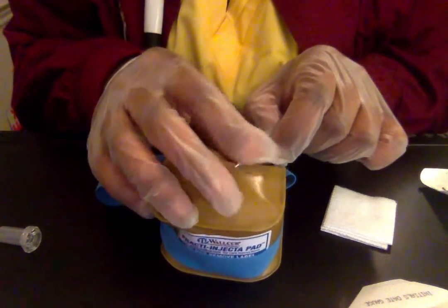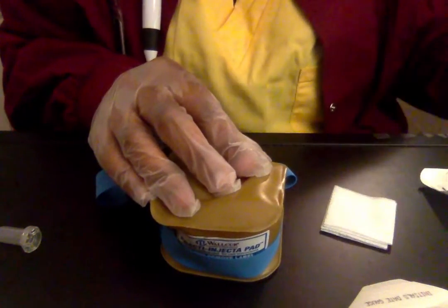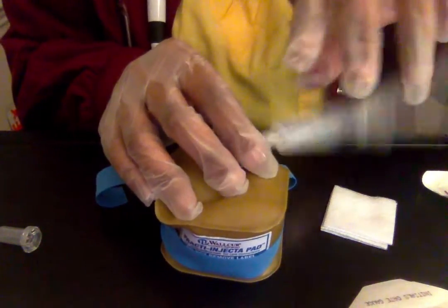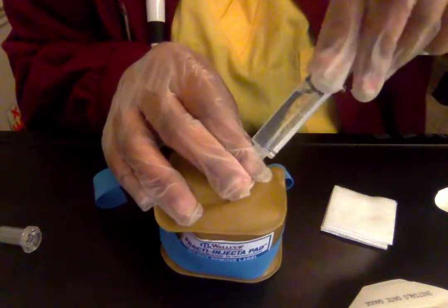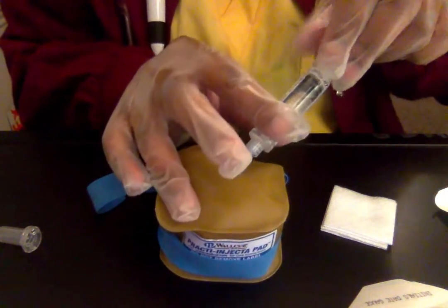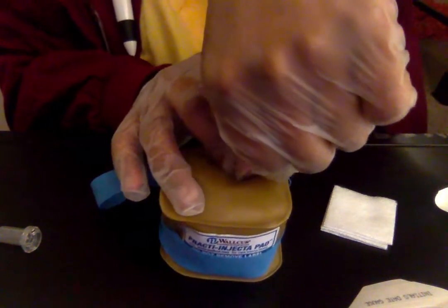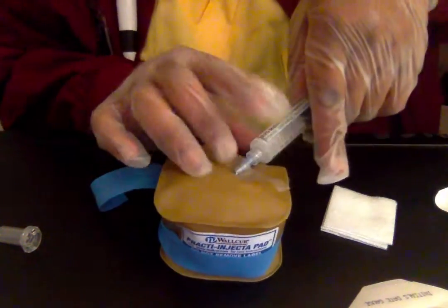Now that I've done that, I'm going to put my catheter, make sure to pull it out. Now I'm going to connect my saline onto it, and make sure not to touch the insertion site. Then I'm going to secure my port right here, still not touching the actual site where it was injected, which is good.